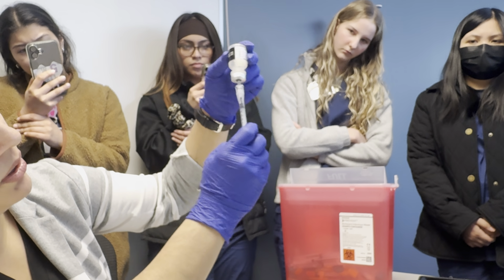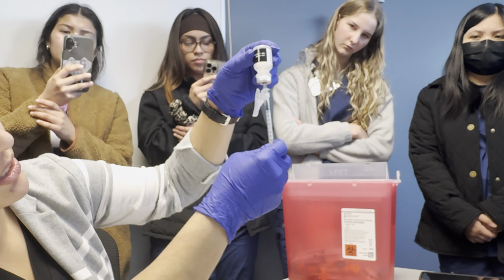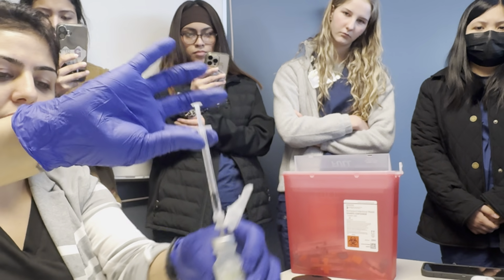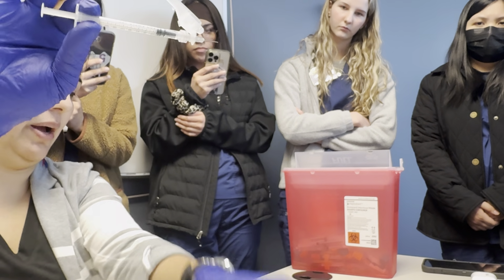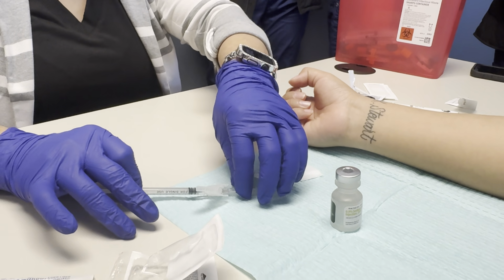Okay, here we go. And I'm going to go right at 0.1. Since I have a bubble, I did not stop at 0.1. I got a little bit more. I'm gonna put this down, gonna grab this, and from here, what do I do? Thank you. And Miss Jasmine is keeping an eye on me, so I'm not touching anything else.